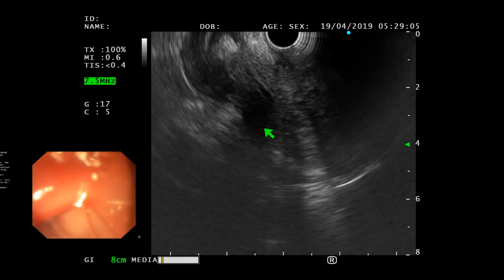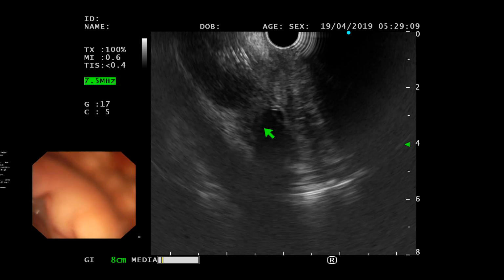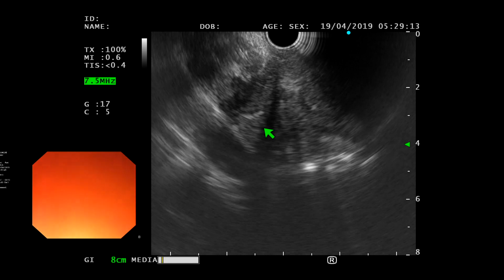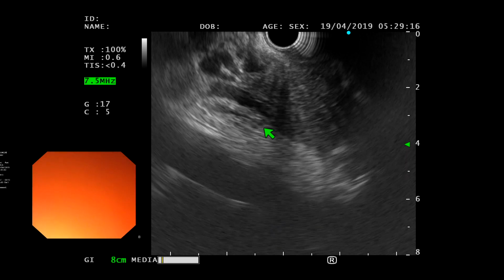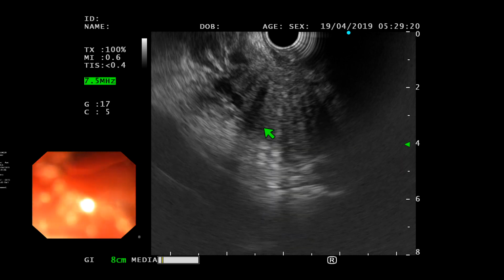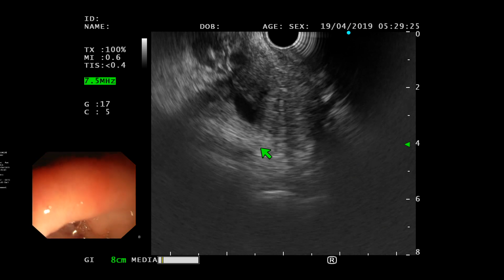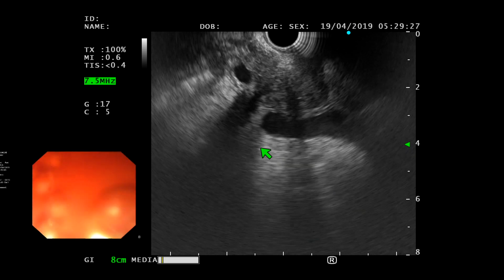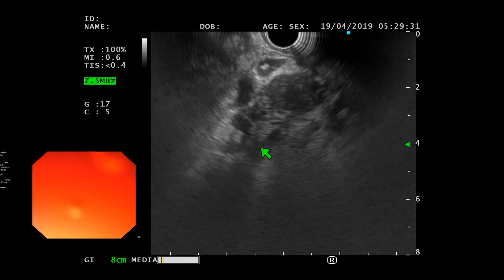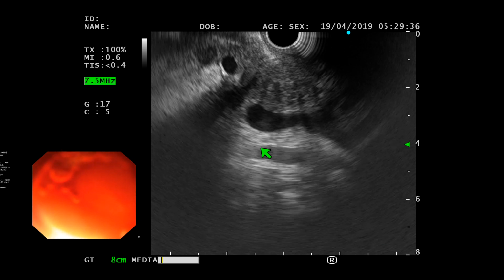Yeah. So there is a slightly slimmer linear by Olympus, which is 11 millimeters. It used to be called the P140. Oh yeah. And one can use it, but your point is totally valid that if you can get to the area of interest and sample it with your current scope, you don't have to push it and especially dilate the duodenum. Needle size. Do you have an FNB? FNB. If it is available, give it, and if not, give the other one.